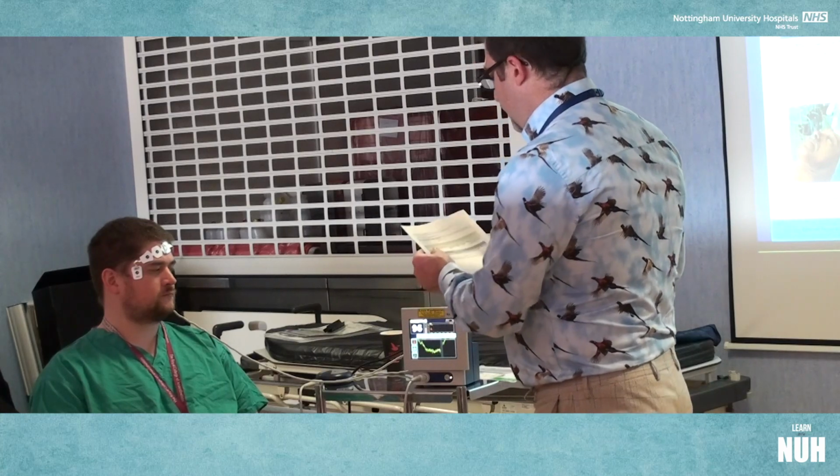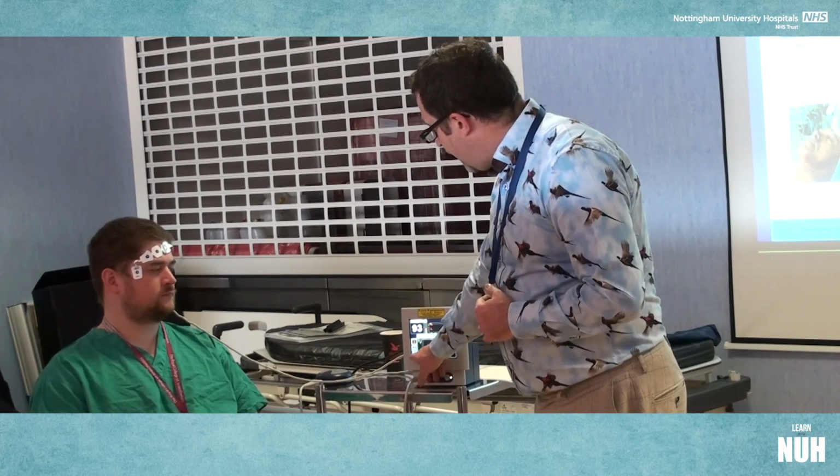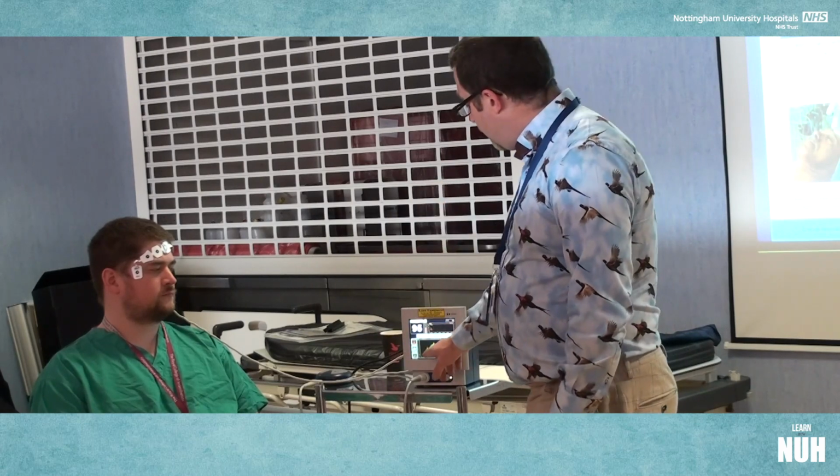Okay, so if we want to check the BIS sensor, we're not sure we've put the BIS sensor on correctly, then press the bottom sensor check button and you can see the corresponding ticks. If there are any areas that you need to press a bit more firmly, it will show you.